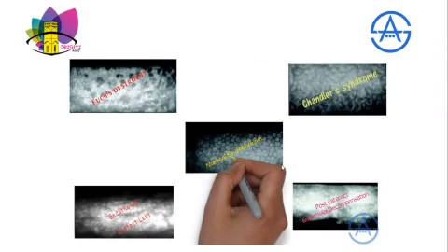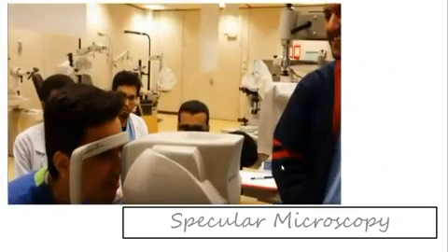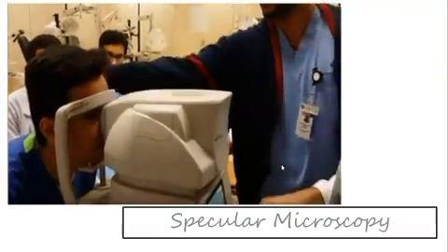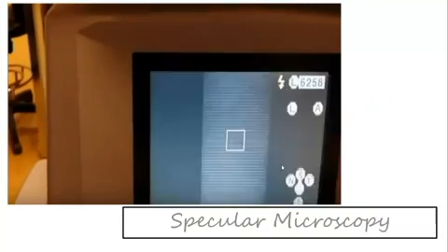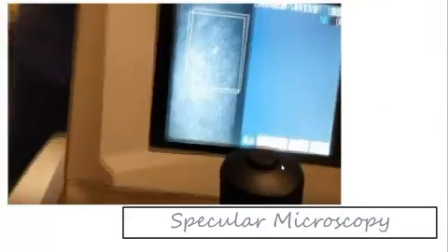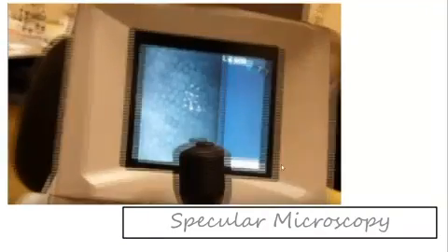So now this is how a specular microscope image is actually taken. The cornea is focused, a snapshot is taken, that is giving us the endothelium. Then we take a fixed frame analysis. Then we count the number of endothelial cells touching two sides of the frame.